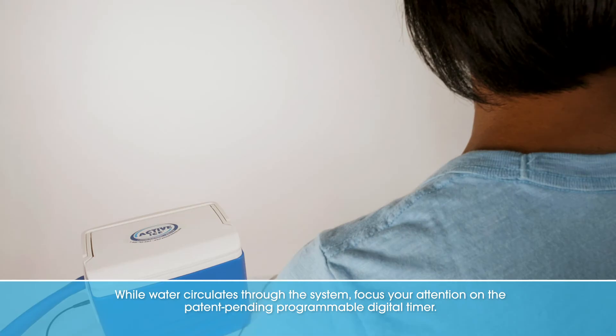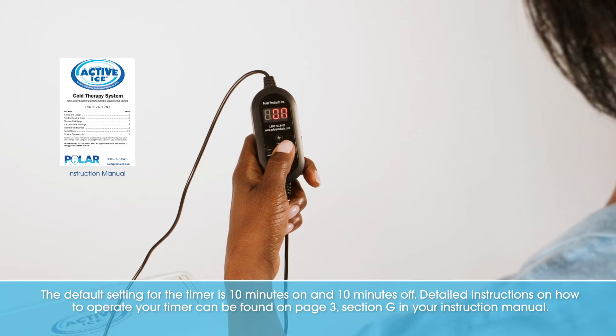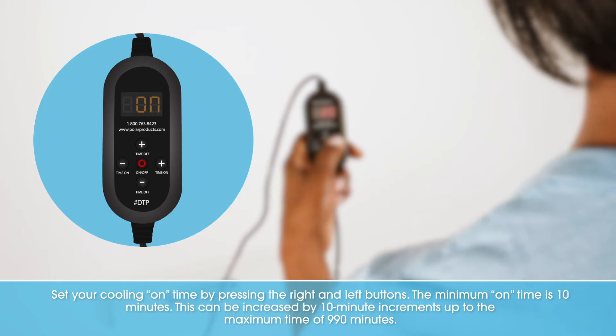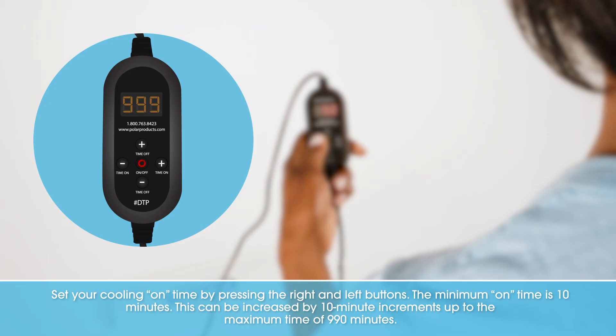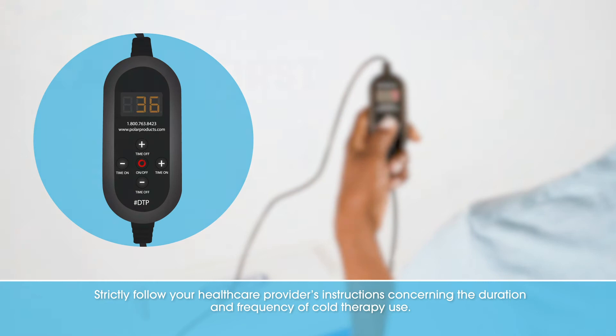While water circulates through the system, focus your attention on the patent-pending programmable digital timer. The default setting is 10 minutes on and 10 minutes off. Detailed instructions can be found on page 3, section G in your instruction manual. Set your cooling on time by pressing the right and left buttons; the minimum on time is 10 minutes, which can be increased in 10-minute increments up to a maximum of 990 minutes. Set your off time by pressing the top and bottom buttons. The timer will cycle the system on and off per the set times and counts down so you know how much time is remaining.